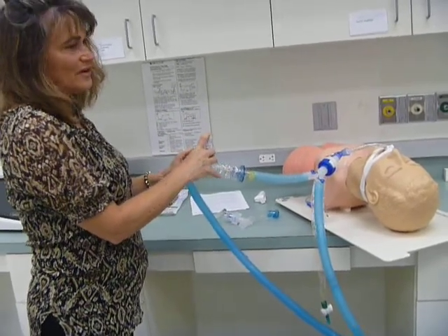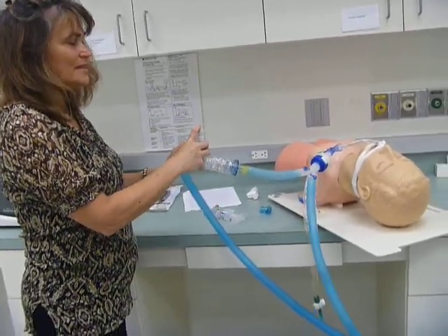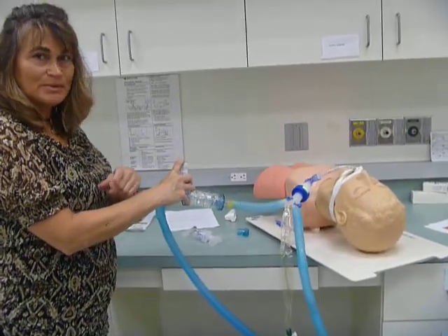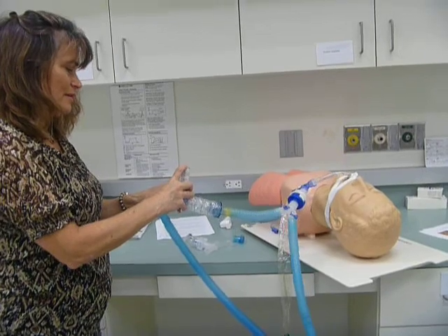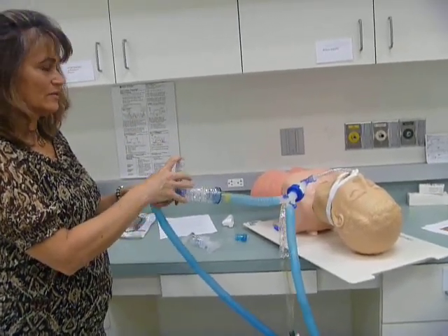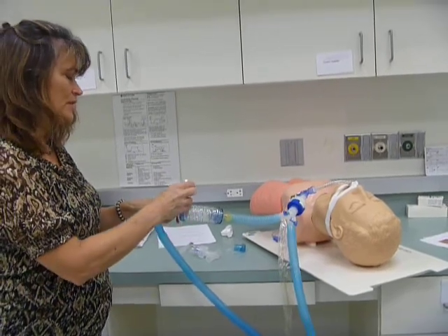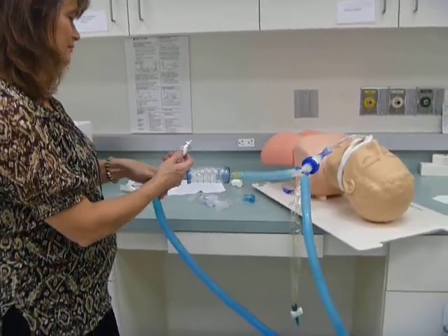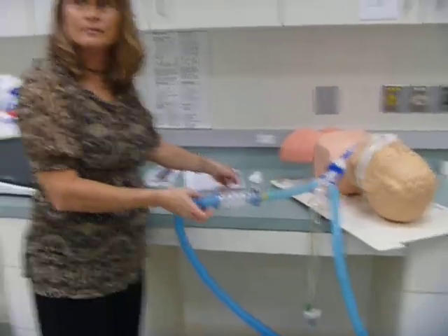Yeah. So I hear the breath going into the patient, and I press this, and then the breath goes in. I wait 1 minute between puffs, press it again, and then it goes in during inspiration. Yeah, so it looks like you're going to have to hold it because it does not stay in place if you push and twist it. So every 1 minute you give a puff? Yes.